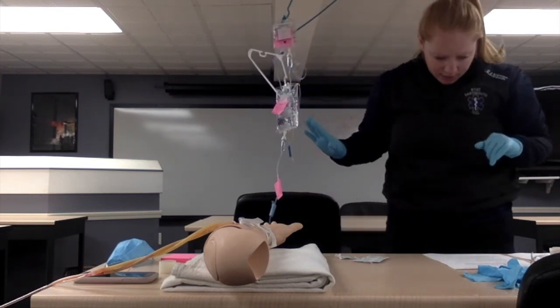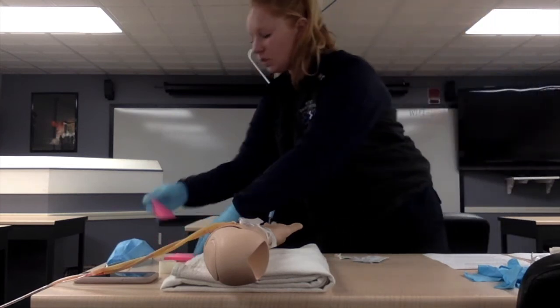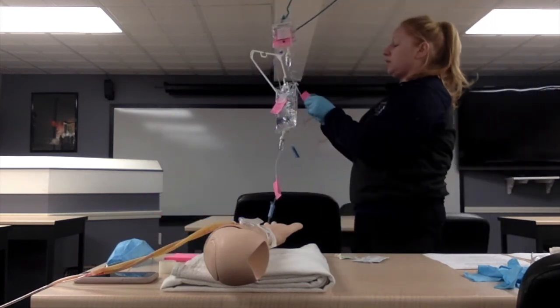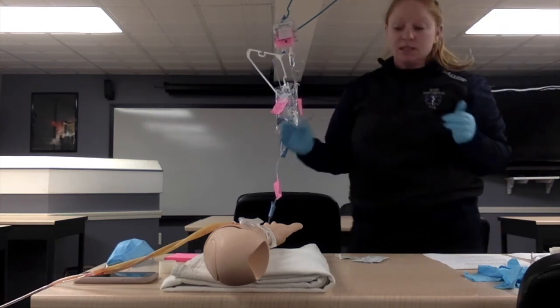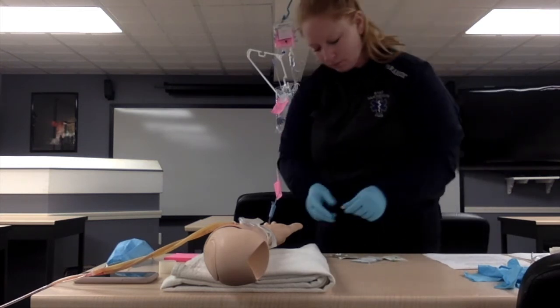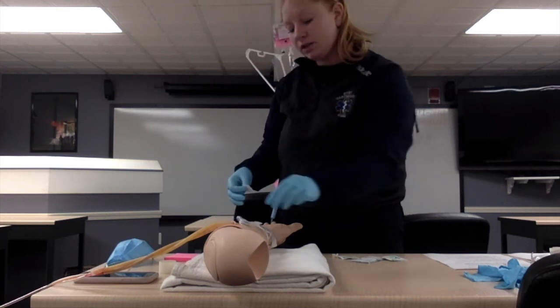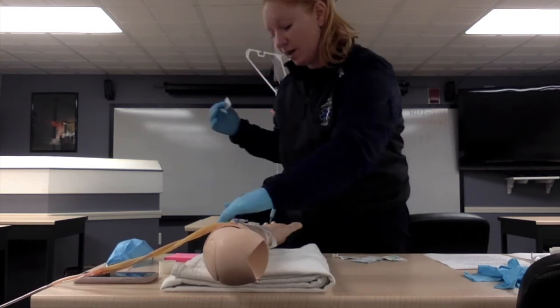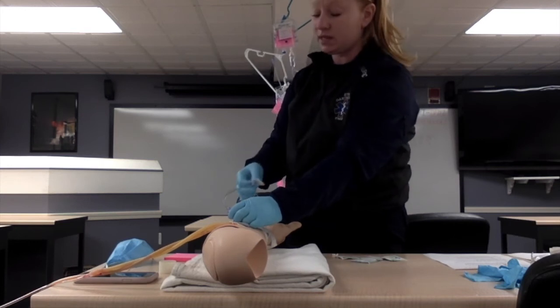So once we have that done, we set up all of that, we labeled it. We're going to also label this line, just so again, because we have the secondary, we want to make sure that we're not confusing them, so we know primary, secondary. We can look at any time to distinguish what line is with what medication. We're going to take another alcohol prep. You can throw that out, make sure you're not touching anything with this. As far as the line, it's going to be the port closest to the primary. This one only has the 2 ports. One is a needleless system, one's a needle system. We're using the needleless, so it's the thread.